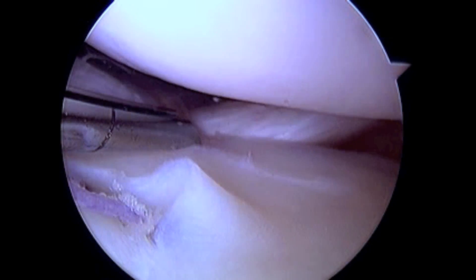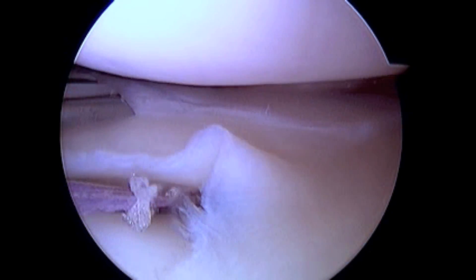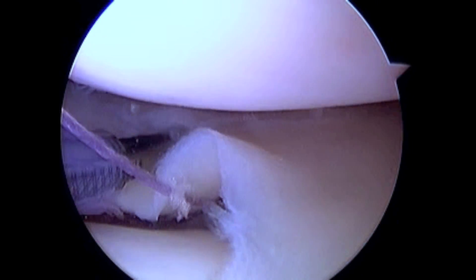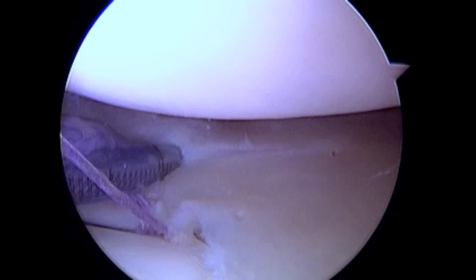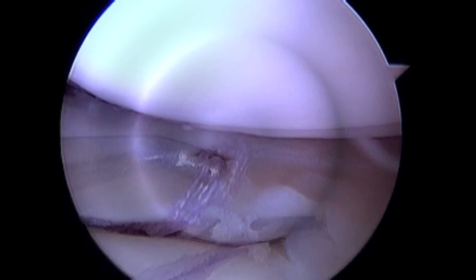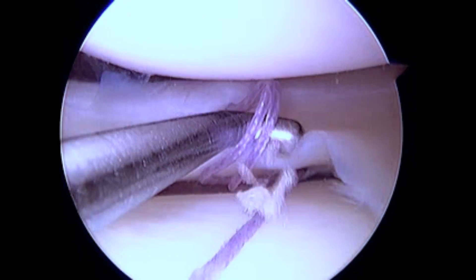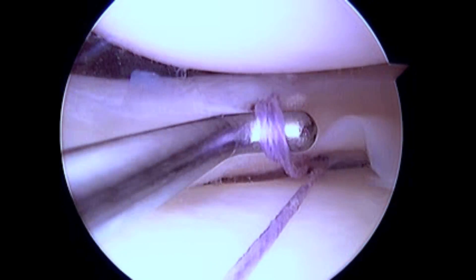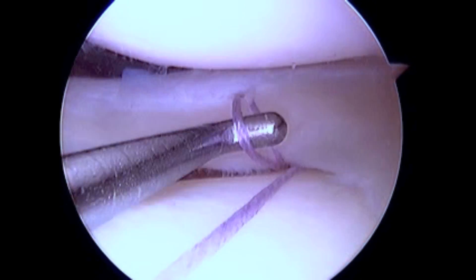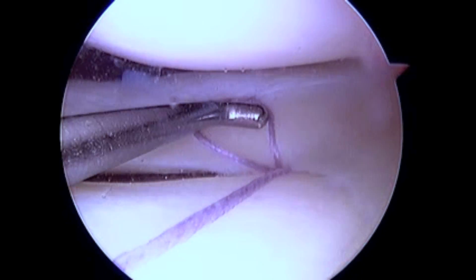There are a variety of suture configurations for all-inside meniscal repair. Demonstrated here is a vertical mattress configuration, which I believe provides the strongest repair for longitudinal peripheral type tear. A probe is used to facilitate tightening of the all-inside meniscal repair system. You can see the two limbs of the high tensile braided suture as we cinch them down to the meniscal surface, bringing the two fragments of the meniscal tear into direct apposition with excellent compression.